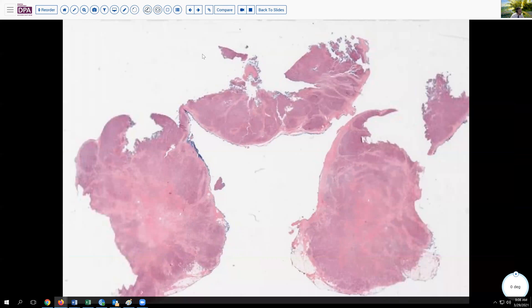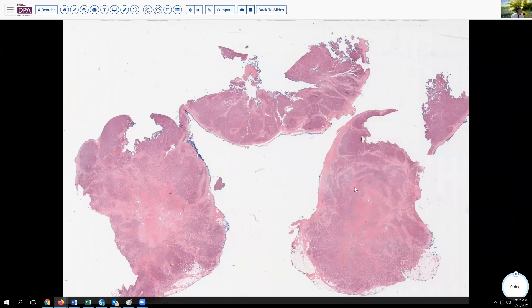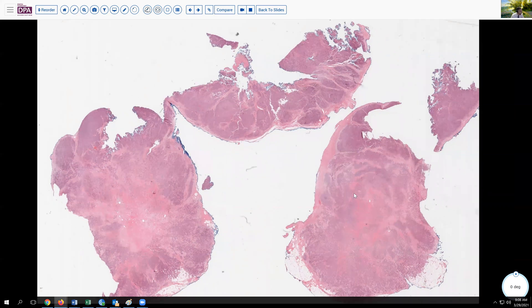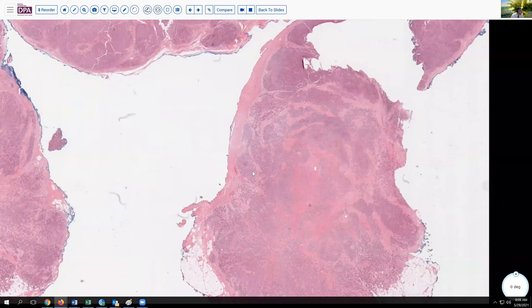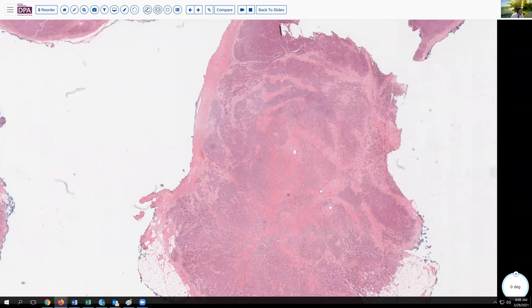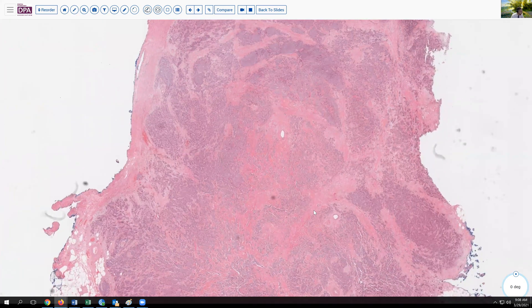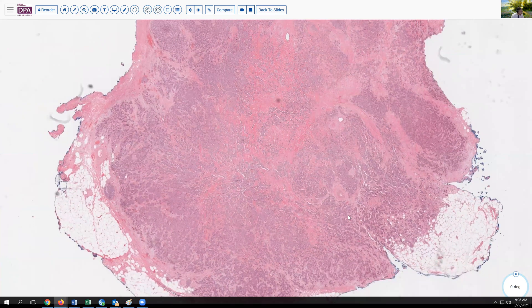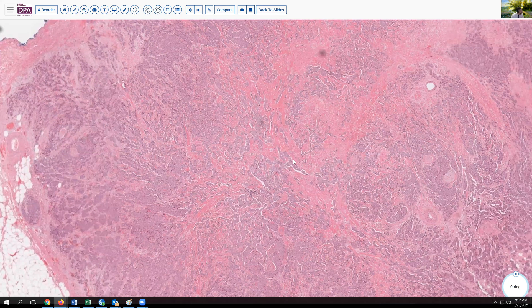With a several-centimeter mass, the patient ultimately came to a sampling of this lesion. Here we see several fragments from this tumor, which was sort of shelled out. Obviously, this is not just a simple adnexal lesion. We don't see adnexal structures here, but instead we see an infiltrative pattern of a mixture of epithelial cells and stromal elements with some interspersed vasculature. We do not see any underlying glandular architecture, ducts, or cutaneous adnexal structures.